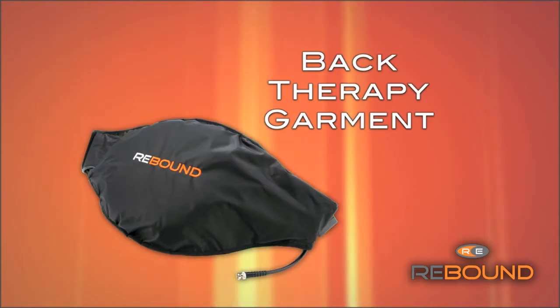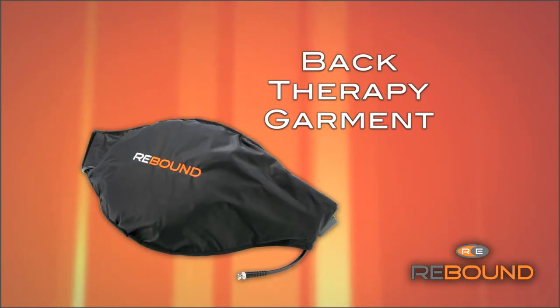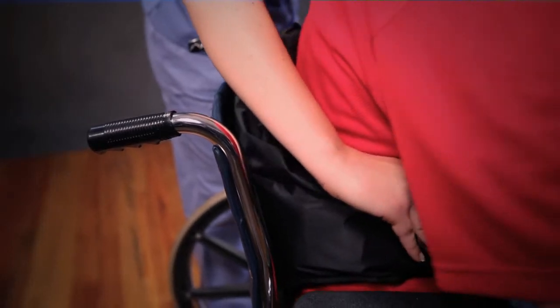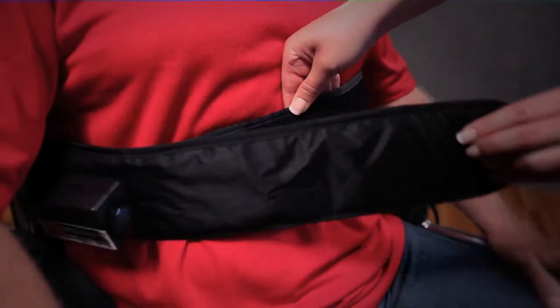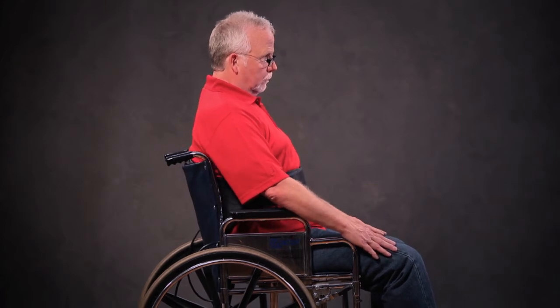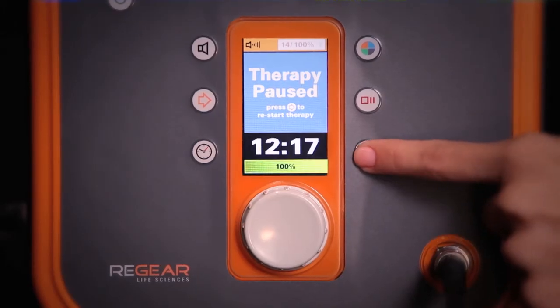Back therapy garment — this is a one size fits all flat pad that comfortably delivers deep heat to large areas of the back. This can be used in the seated or lying down positions. The velcro strap is for convenience; it does not need to be attached. Please note that when a patient is leaning against the back garment, the foam compresses and it may feel warmer to the patient. If a patient states that it's too warm, or if you know that they are sensitive to heat, simply reduce the intensity.